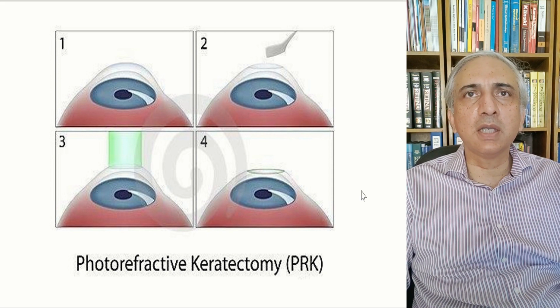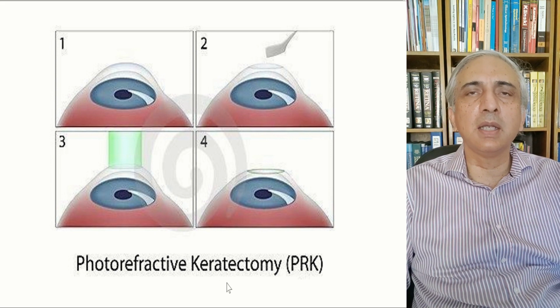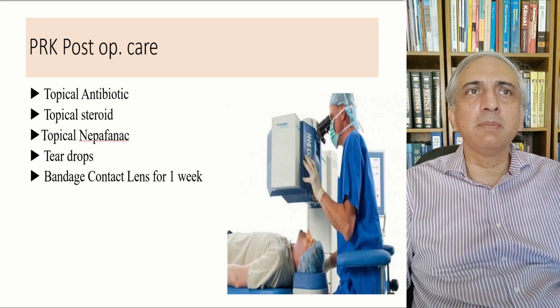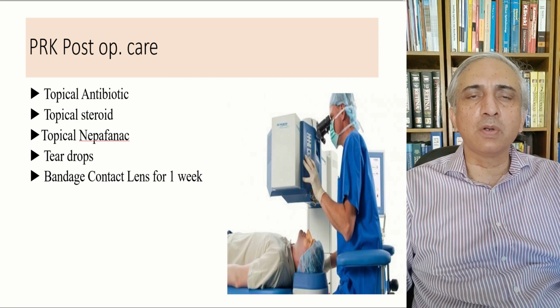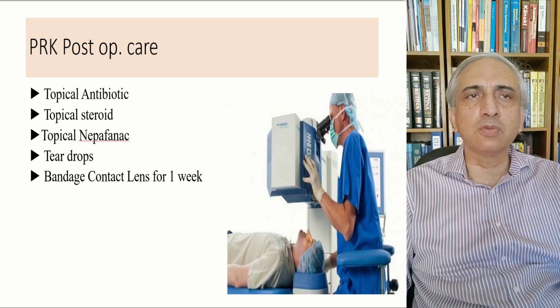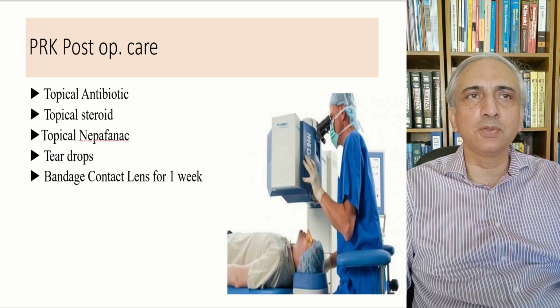So use a hockey stick in a predetermined area, and then you would use a laser and then put a contact lens after that. So post-op care is topical antibiotics, topical steroids, topical non-steroidal anti-inflammatory. The topical antibiotics are used initially for about 2 or 3 weeks. Topical steroids are used for 6 weeks. Topical non-steroidal anti-inflammatories are also used for about 2-3 weeks.